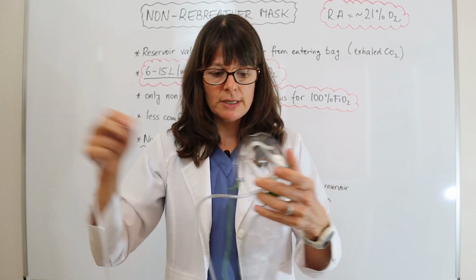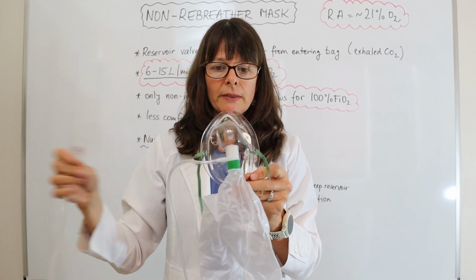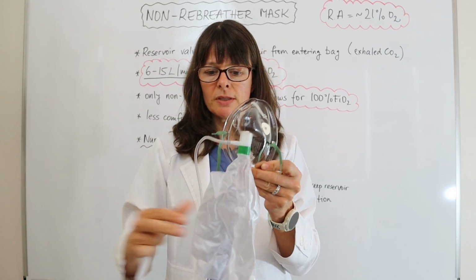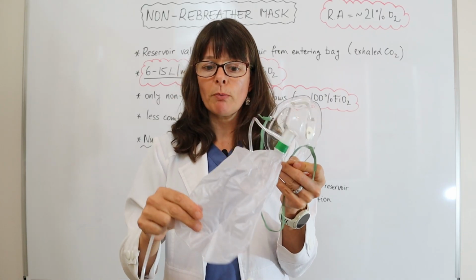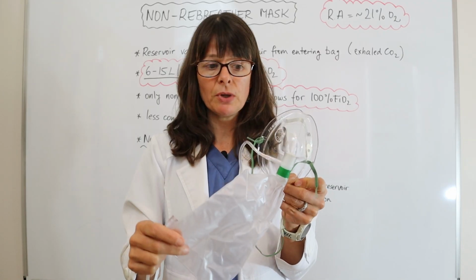the oxygen tank. And then this reservoir bag, before you put the mask on the patient, make sure that you hook it up to the oxygen source and that this bag fills up quite a bit before you put it on a patient, because this reservoir bag will now contain the oxygen that the patient is breathing.